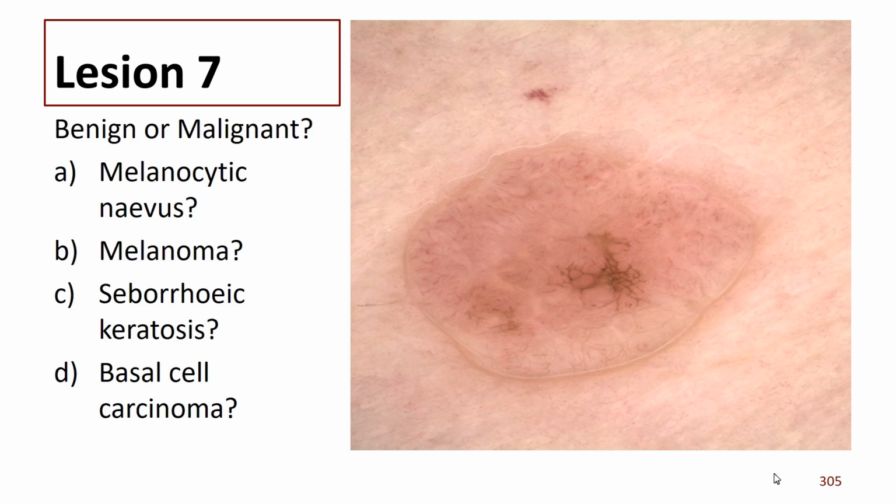So dermoscopy can give us the wrong answers when we're a beginner. Remember, take a history, examine your whole patient with the naked eye. Then get out your dermatoscope. Use your dermatoscope over the whole patient, looking at the harmless lesions first. What is the normal pattern for this patient? And then if you do see something that's different from the others, then you can look at it more closely. The patient always thinks that's funny.